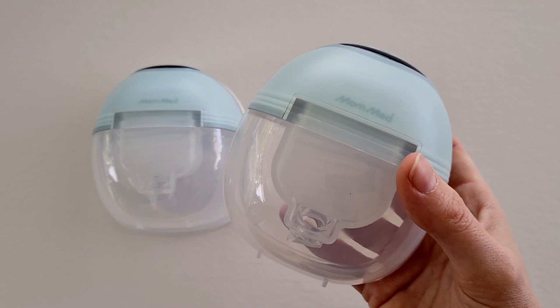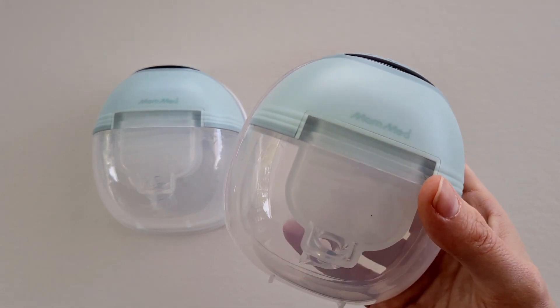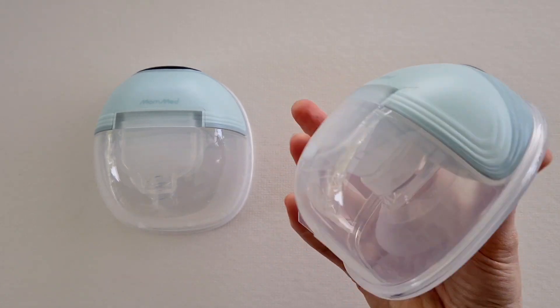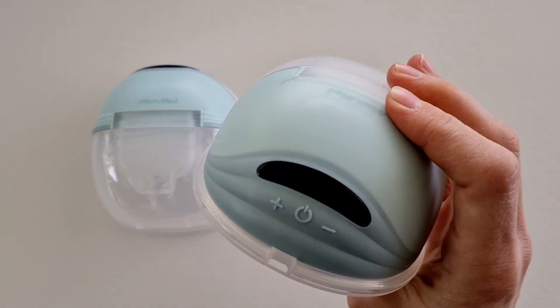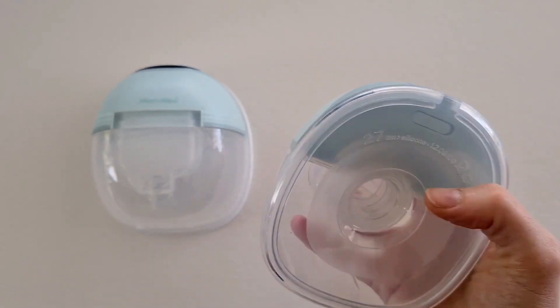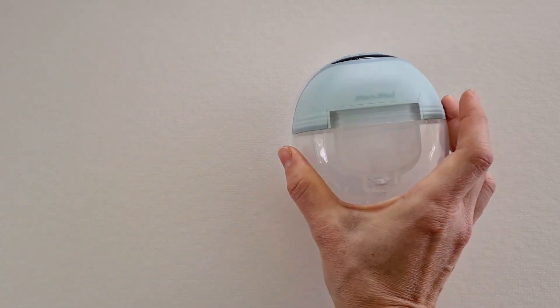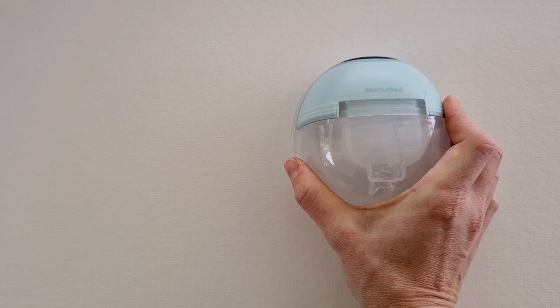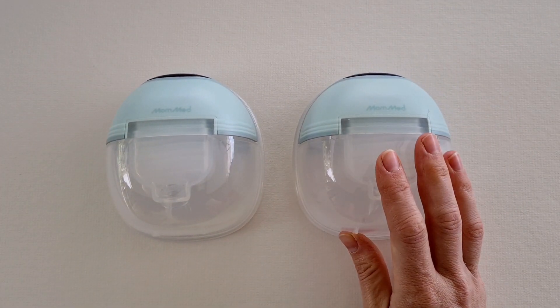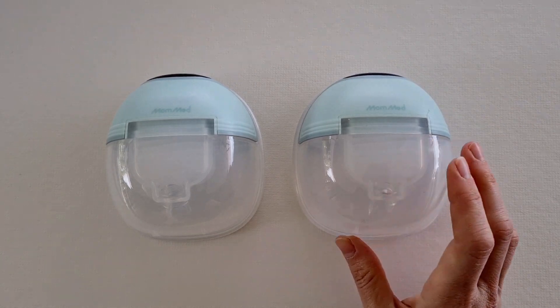It's also really lightweight, which I love — it's only 230 grams per pump, which is extremely lightweight. You can also use it as a single on either side, or you can use it as a double.